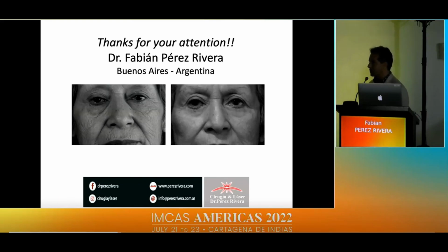Okay. How often do you use a second session after using radiofrequency? Always 3 or 4 sessions, never only 1. Radiofrequency is too gentle to give a solution for the skin, for wrinkles, for pores. You need at least, in my hands, 3 or 4 sessions. Different from CO2. How long do you wait from one session to another? Good question. My rate is every 15 days. Every 15 days, in 2 months, I complete the treatment. Okay, thank you. Anyone?